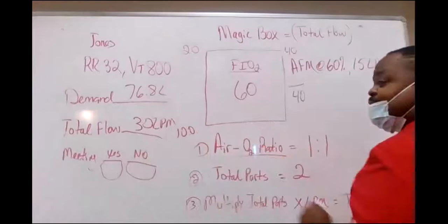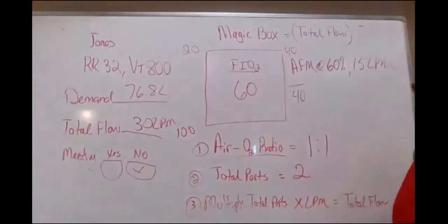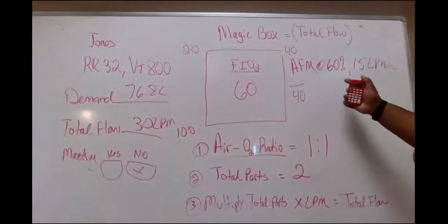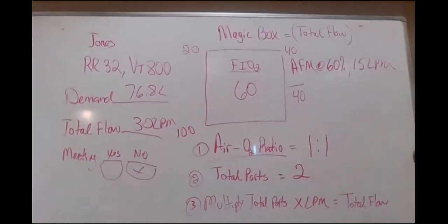Now, am I meeting his demand? No. I am not meeting his demand. He demands 76, and I'm only giving him 30. So what do you think I could do to get that flow up? Decrease the FiO2.